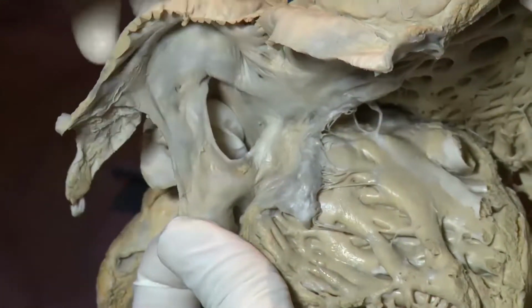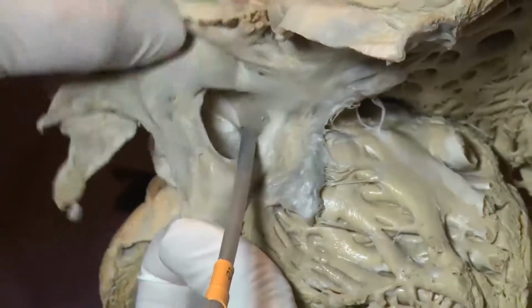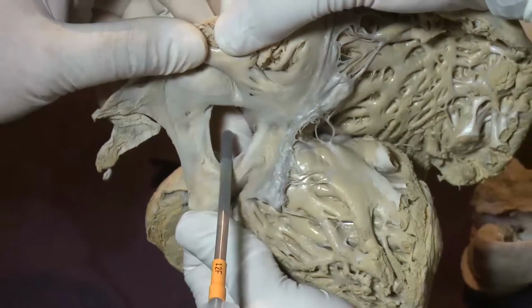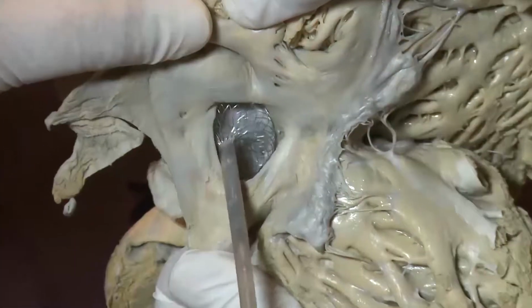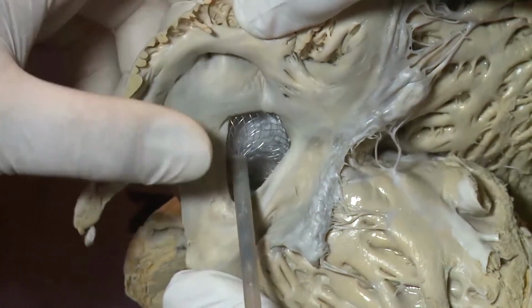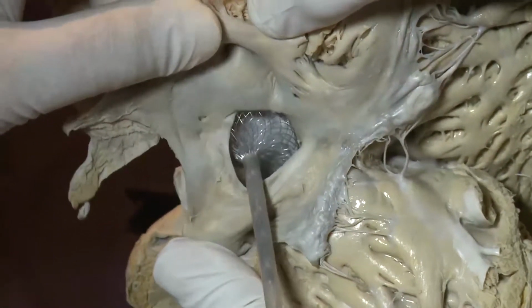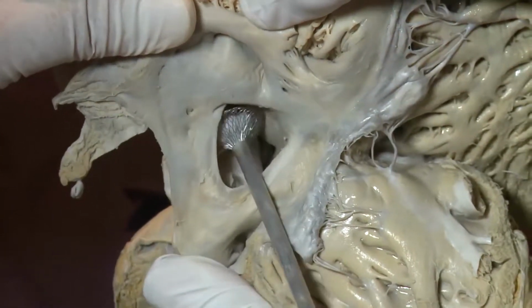So in this case, this is a device. From the femoral vein, IVC, we cross the ASD, open the LA disc like this, and pull back. When you pull back the device, the problem is it can prolapse. It first touches the anterior superior portion, so one technique is to rotate the whole thing posteriorly and open the device.